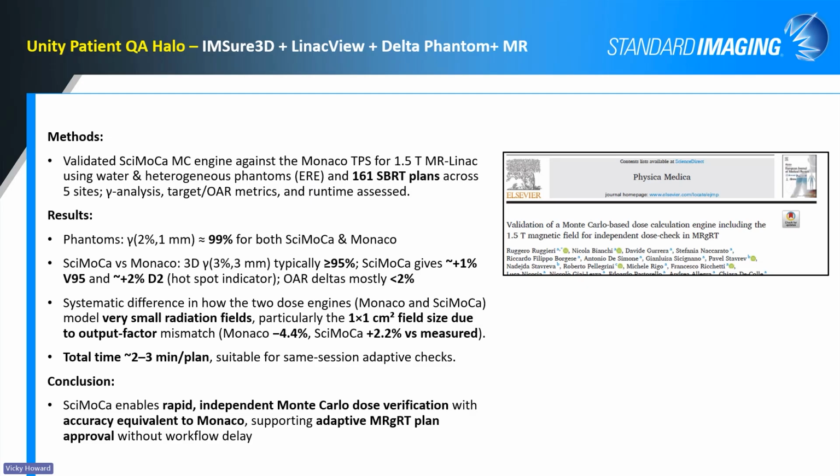I'm not going to go over the performance of the Delta 4 Phantom, MR Phantom, but we can give you that separately if you need that. But for now, I'm going to go into a few publications that have come out recently that look at both SIMOCA, the Monte Carlo engine in IMSure 3D, as well as LinacView. And one specifically, this one for the Elekta Unity workflow. So this is a study that validated the Monte Carlo-based dose calculation engine, which is SIMOCA. We used it in IMSure 3D in a 1.5 Tesla magnetic field treatment delivery environment.